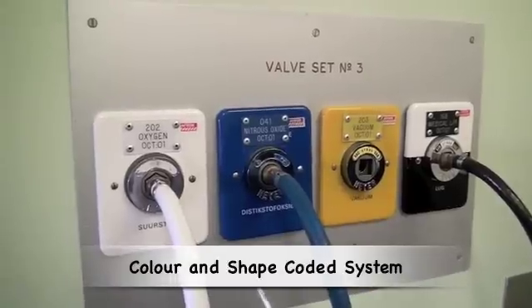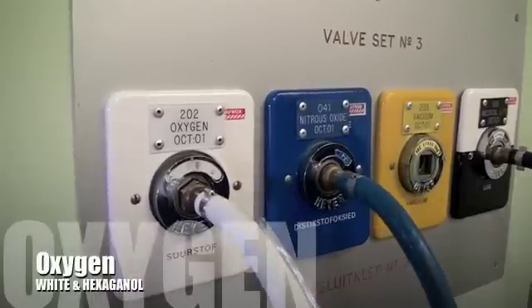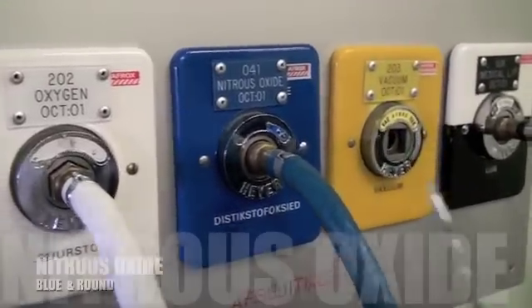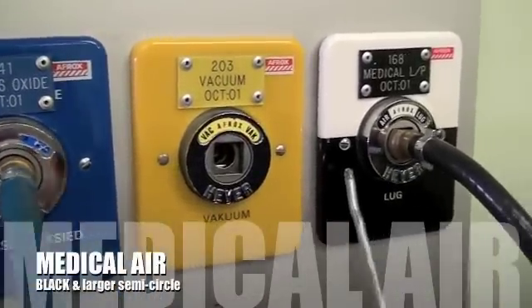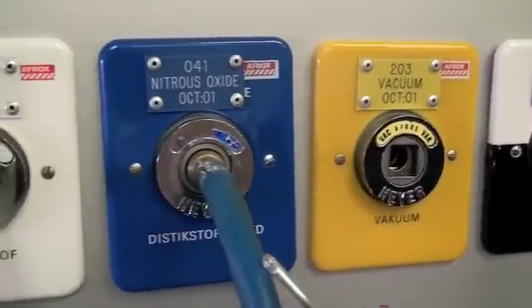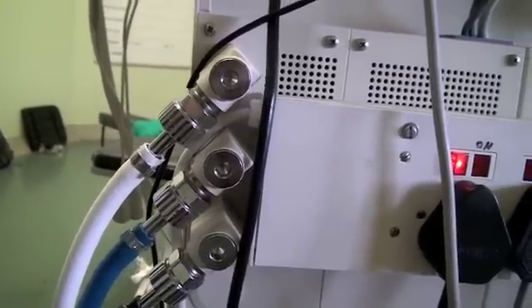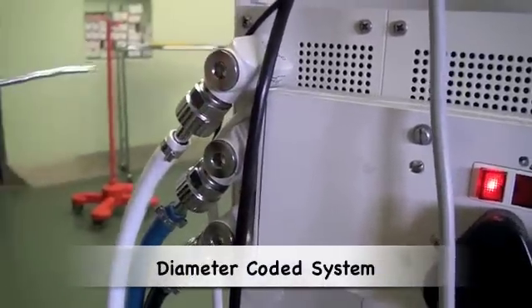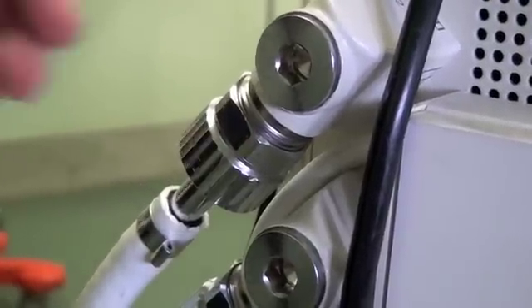Having turned the machine on and checked the power supply, we now move on to checking the gas supply. Each gas has a color-coded and shape-coded system. Oxygen is coded white, nitrous oxide is coded blue, and medical air is coded black. The color coding at the wall corresponds with the color coding of the pipeline to the machine. At the back of the anaesthetic machine, where gas enters, there is a diameter-coded system so that only a specific gas can be connected to each port.